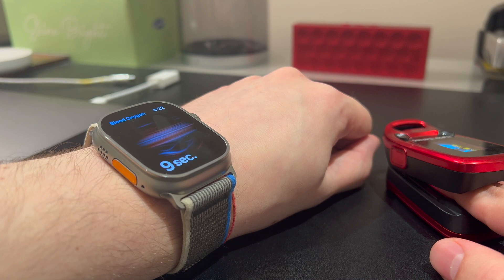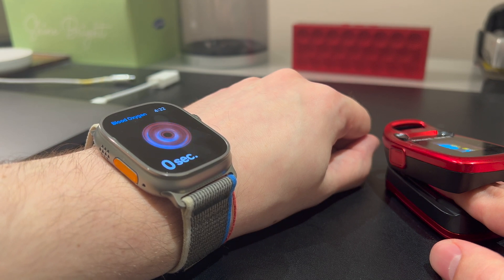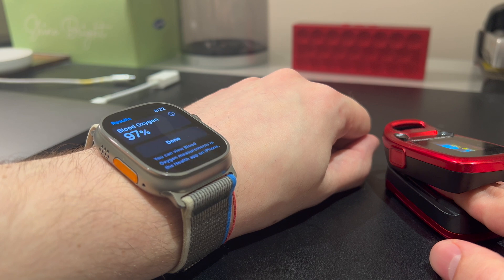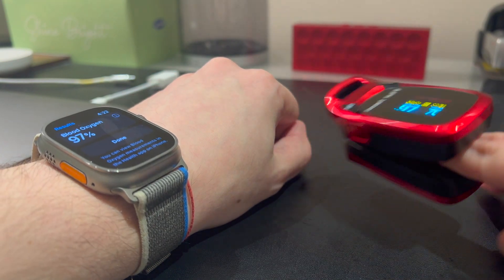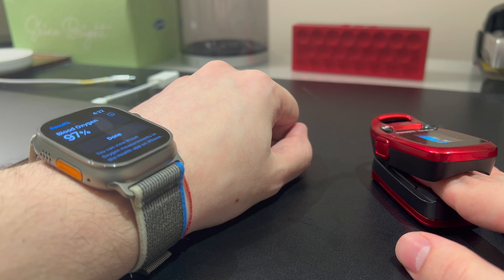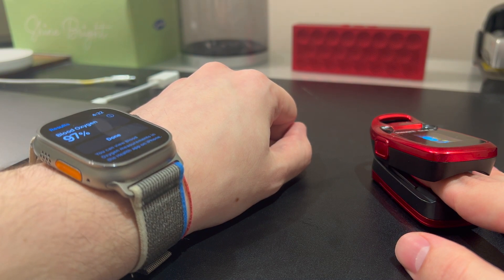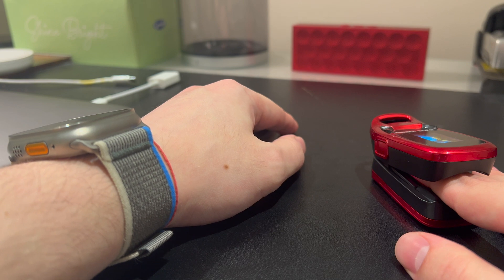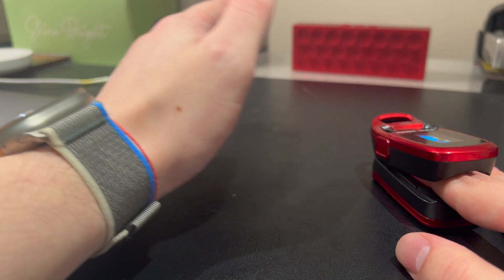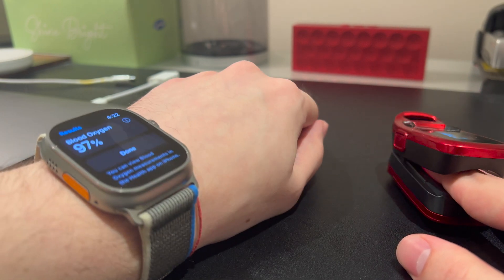The healthy range for blood oxygen is between 95% and 100%, and medical practitioners will tell you that when you're sitting down versus lying down versus standing up, your blood oxygen can definitely vary. So 97%, 97% again. If you've been lying down, your blood oxygen will be lower, but if you get up and your blood starts pumping through your body, your blood oxygen will become more saturated because your blood is being circulated throughout your body more to facilitate your movement. That's definitely something to keep in mind whether you're using a medical-grade monitor or the Apple Watch Ultra.